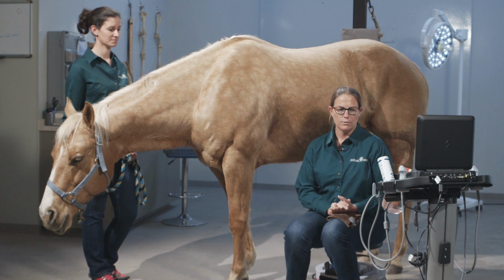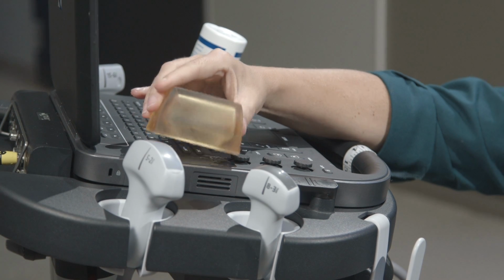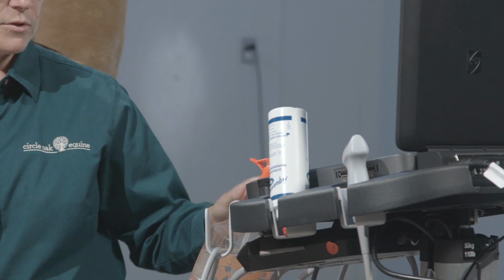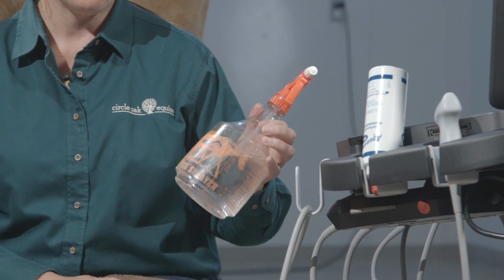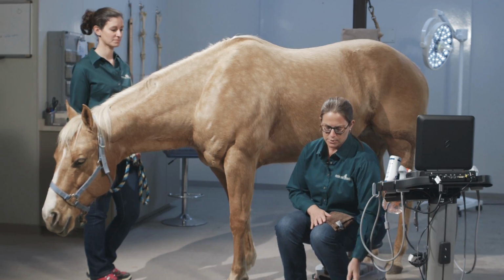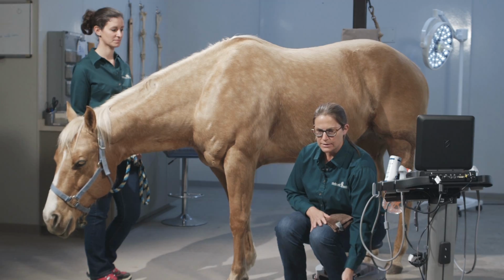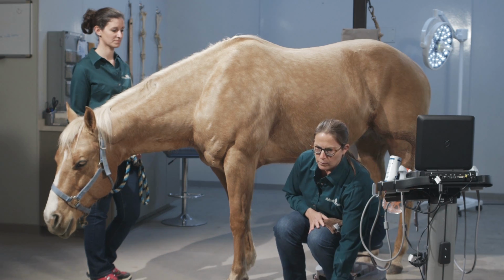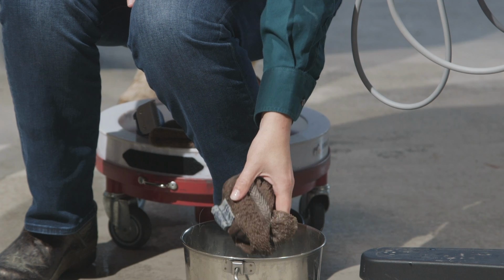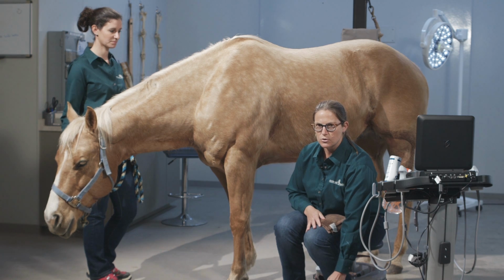And the tools that we're going to be using are a good quality ultrasound machine. We're going to be using a standoff for some situations. We're going to be using ultrasound gel. Also, we're going to be using rubbing alcohol in either a spray bottle, or you can use it in a pour bottle as well. And then, most importantly, we're going to be using a bucket full of warm water with a little bit of chlorhexidine soap and solution in it, and a rag. I found that the rag does a much better job than roll cotton because the roll cotton tends to leave a little bit of debris behind when you're scrubbing it on a leg.